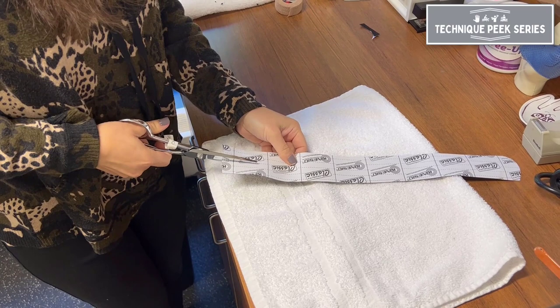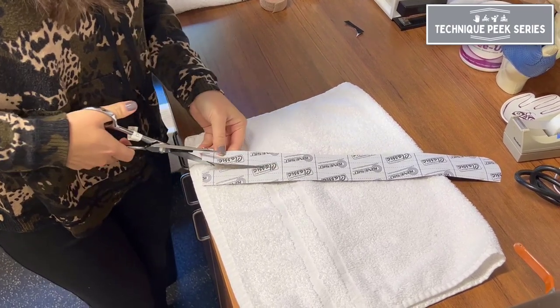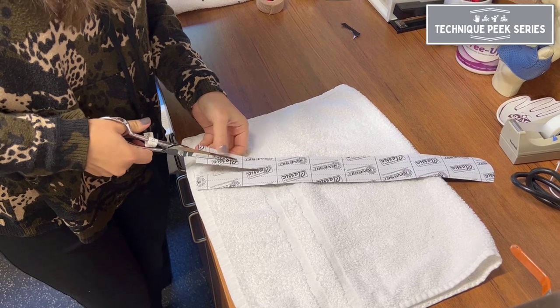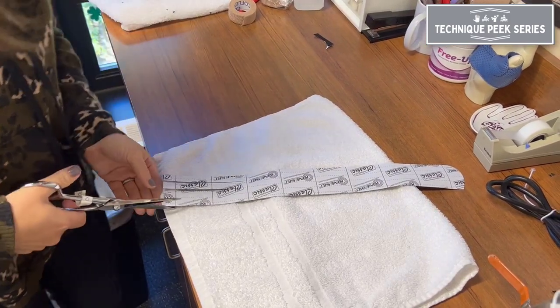Next, to cut the tails for each finger, you'll want to start by cutting the strip in half, and then each half in half again, to have four tails for each of the four fingers to be included in this taping technique.